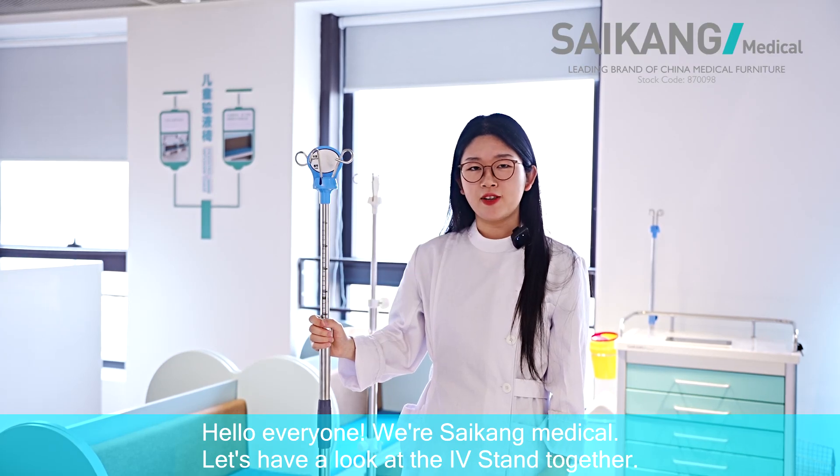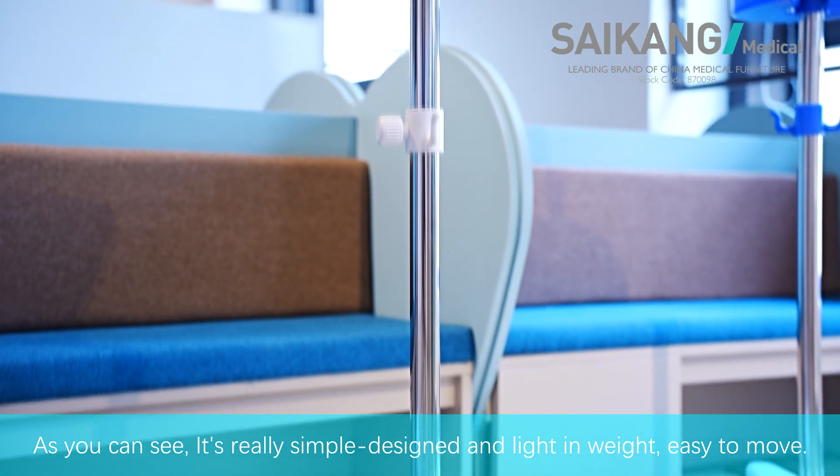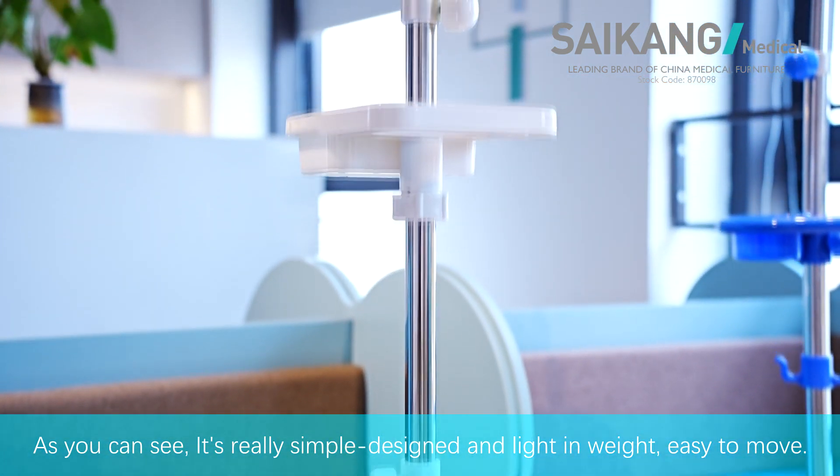Hello everyone, we are Saikang Medical. Let's have a look at the IV stand together. As you can see, it's a really simple design and light in weight, easy to move.